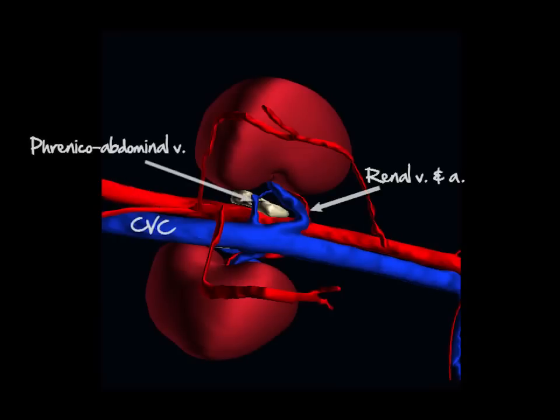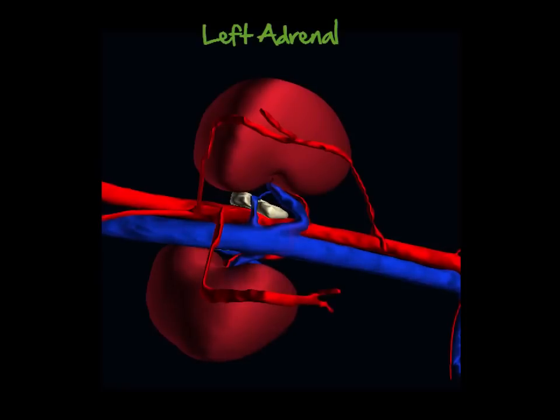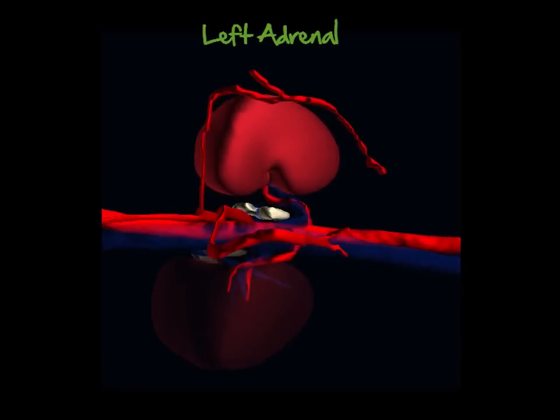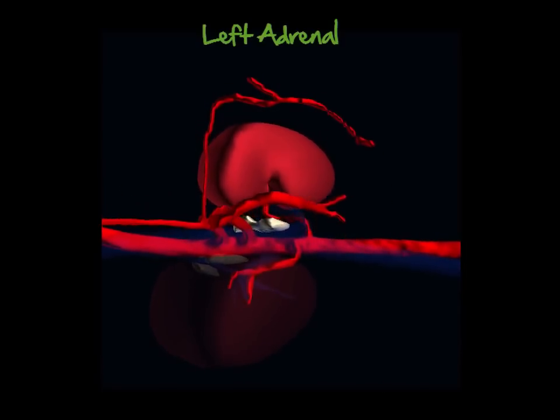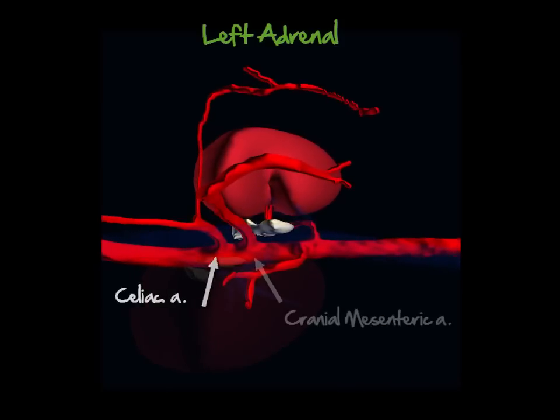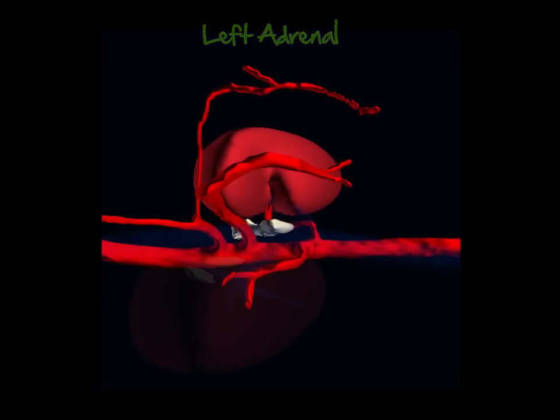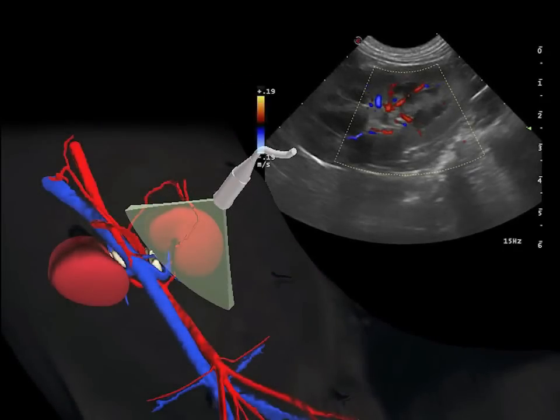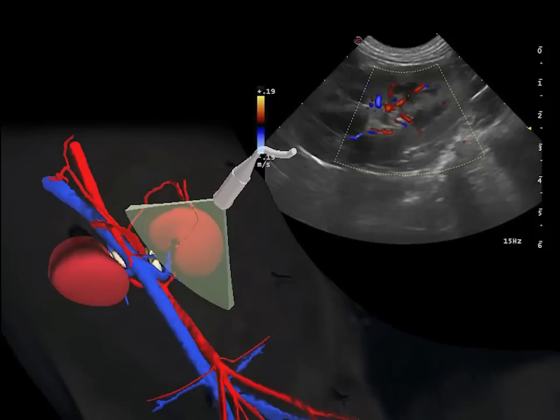Being able to recognize the vessels close to each adrenal gland will ensure that you can identify them with certainty. A convex probe is generally used to assess the left adrenal gland, at least initially. Color Doppler can help you identify the vascular structures in the region of the left kidney, which in turn helps to identify the adrenal gland.